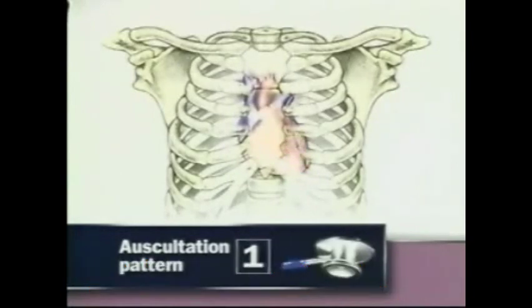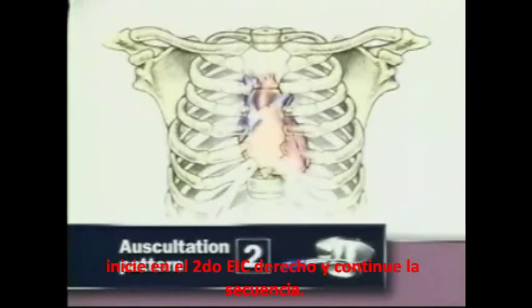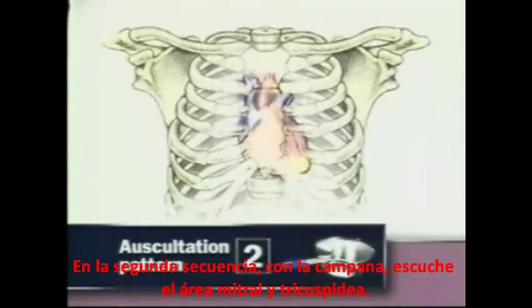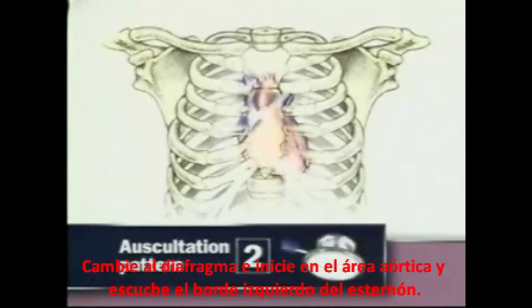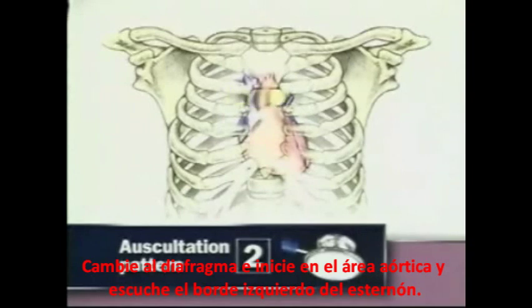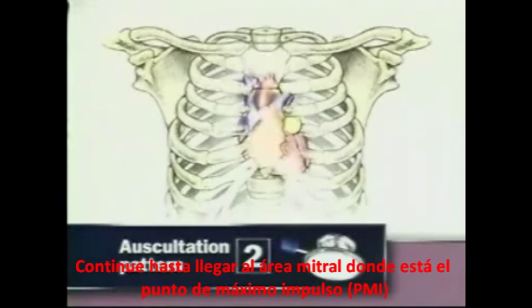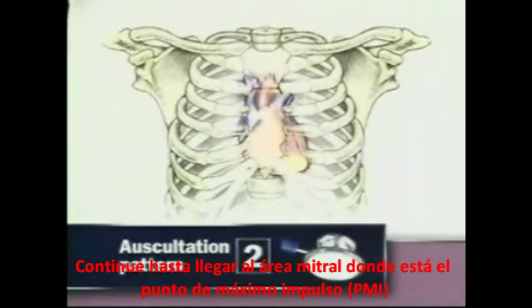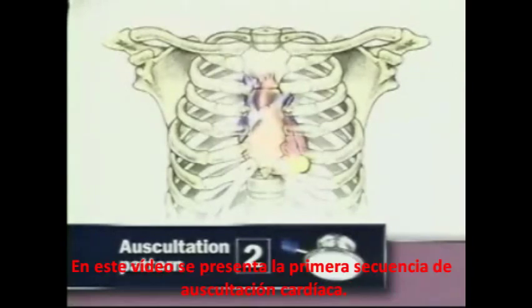Starting in the right second interspace helps orient you to the cardiac cycle. In the second sequence, start with the bell and listen first at the mitral and tricuspid areas. Then change to the diaphragm and, starting in the aortic area, listen to all five areas from above down. Starting at the mitral area is useful when you've had to turn the patient to find the apical impulse. The first auscultation sequence is shown in this video.